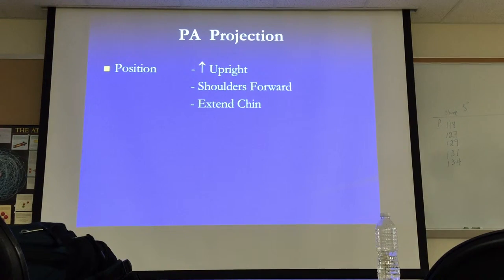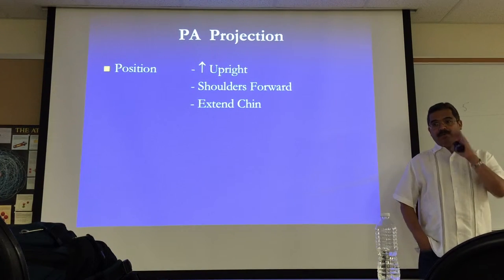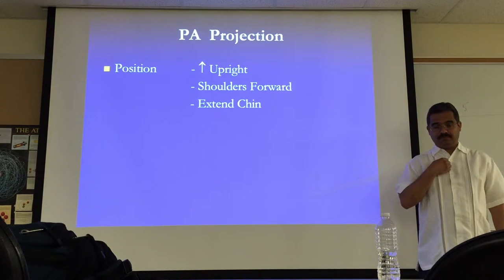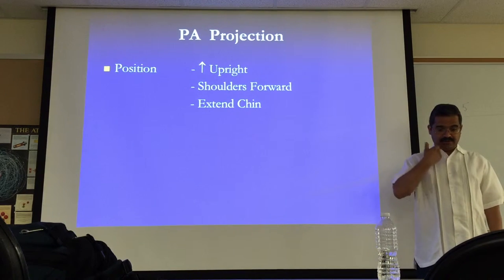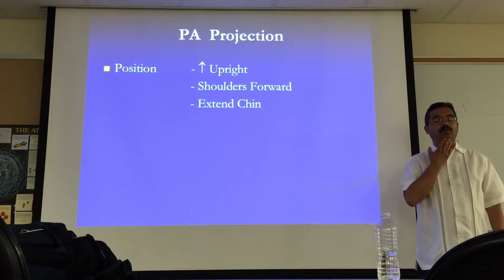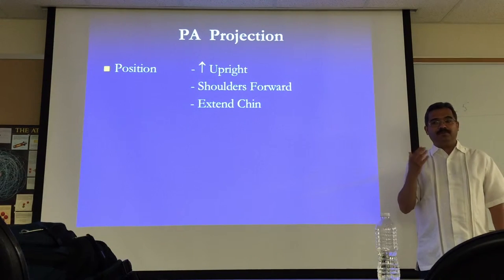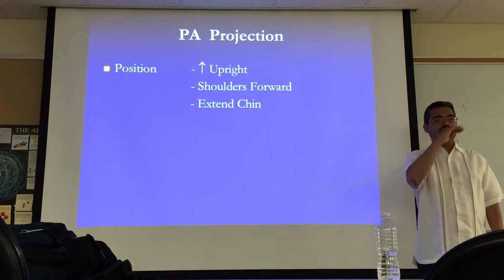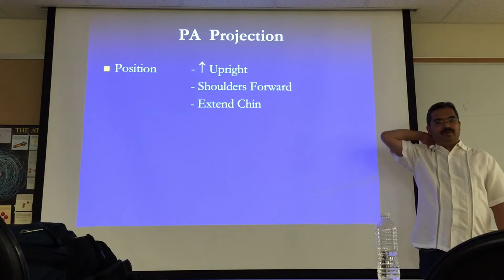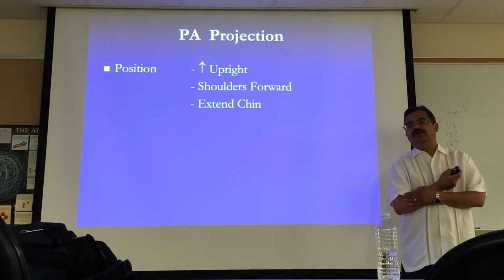Next, extend the chin. The purpose of extending the chin is so you don't have the chin over the apex. Sometimes patients will be slouched and the chin is right over the apex, so you want to just bring it straight up. You don't want to bring it up too far because then you have the occipital bone over the apex and you defeat the purpose. So it's just straight — you can elevate it a little bit, but if you see the occipital bone over the spine then that's too much.